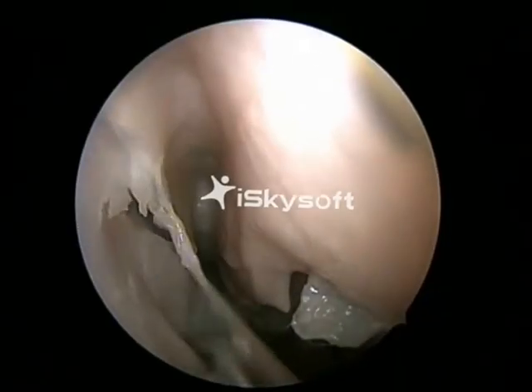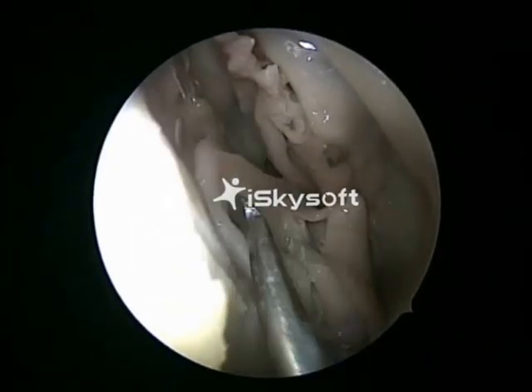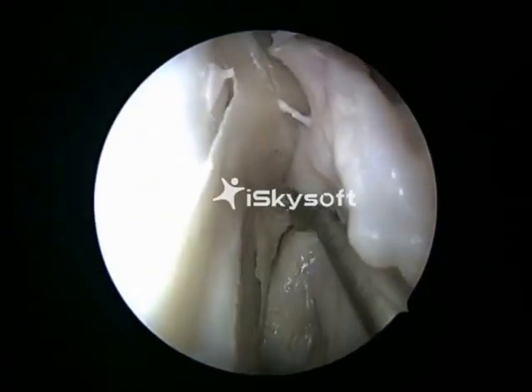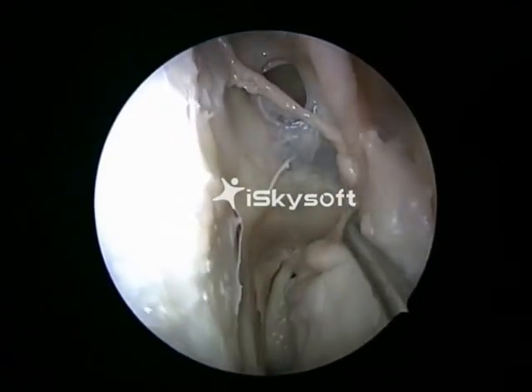And now the flap is pushed posteriorly. It's turned laterally towards its pedicle.